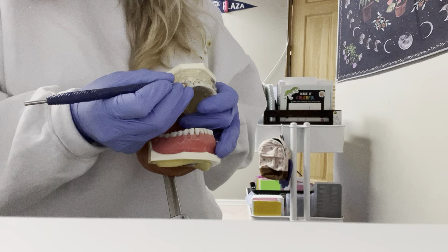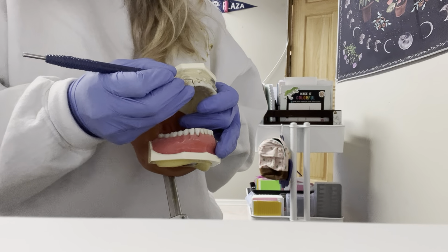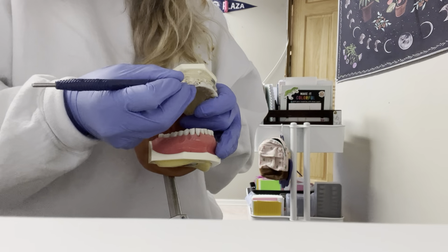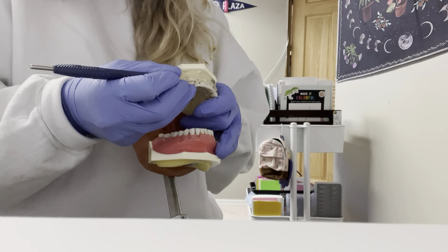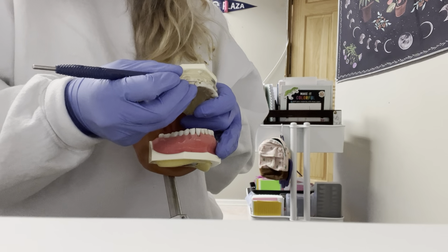Probing will also indicate if there's any inflammation. If there is significant inflammation, some patients will bleed. Always do the walking method, end on an angle.